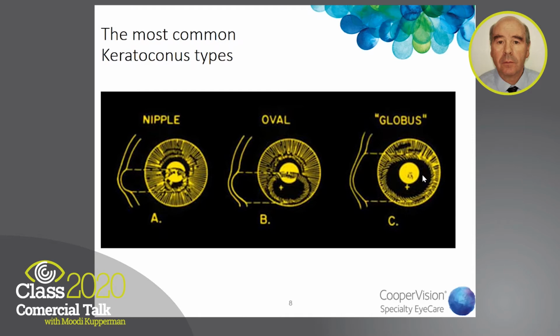The patient can see very nice with spectacles. His other eye was something like the oval, which has a very bad vision. So he asked me if we are going to fit semi-scleral lenses in both eyes, and I told him, look, show me please the topography. And when he showed me the topography, he immediately understood that he has to go to the same solution in both eyes.